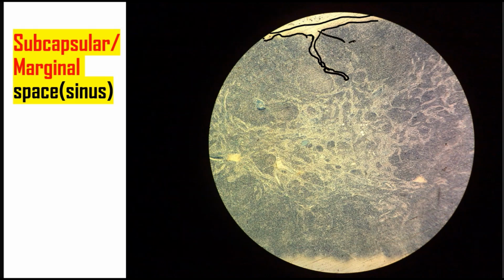So here, this is the capsule. This is the trabeculae. This is the outer cortex. And then this is the inner cortex. And where you find the light space here, this is the medulla.